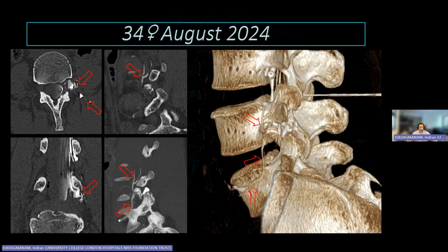Well, when we did the decubitus myelogram, you can see that the meningeal diverticulum filled, and you had some egress of contrast through these channels. Quite hard to work out what they were. So it could be a type 2 leak. But when we amalgamated the data set, doing what we call maximal intensity projections, you can see these ramified structures. So this was a CSF venous fistula arising from that meningeal diverticulum at about the level of L4 on the left, causing radicular symptoms.